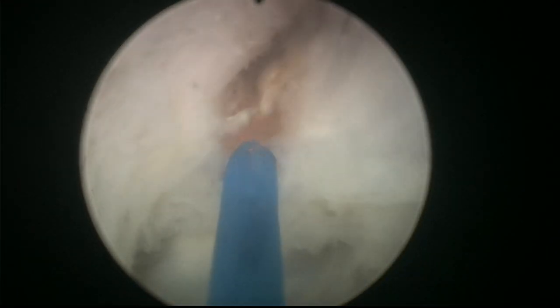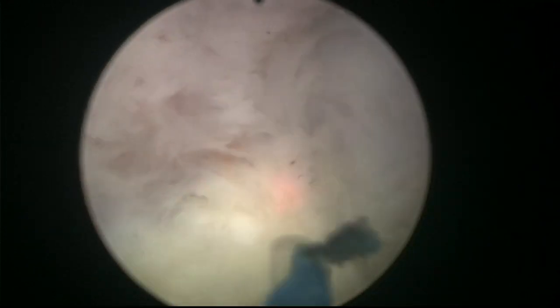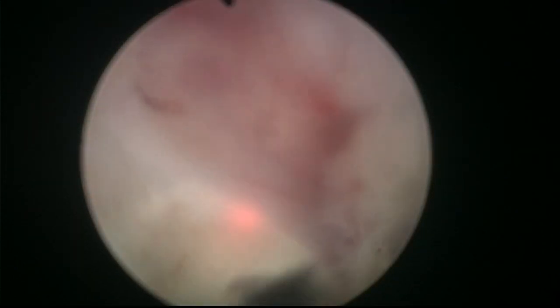Instead of following the incision and trying to reach the level of the capsule without really being able to tell where the capsule is, what we are going to do is bring the plane from below. Here is the good plane — so I'm going to continue with this incision from below. You can see the good plane here, and then we can bring this depth upwards. It is much more intuitive and much more simple.